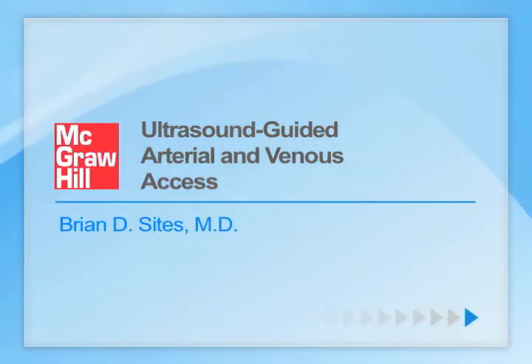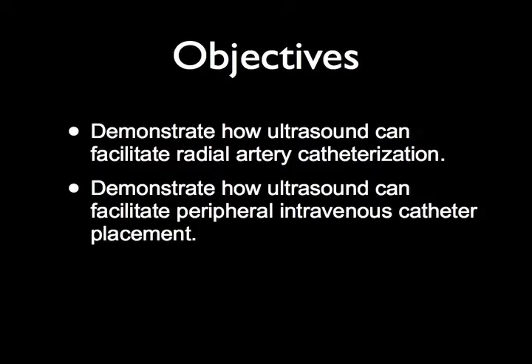Welcome to Ultrasound Guided Arterial and Venous Access. There are two objectives with this video. We wish to demonstrate how ultrasound can facilitate radial artery catheterization and demonstrate how ultrasound can facilitate peripheral intravenous catheter placement.